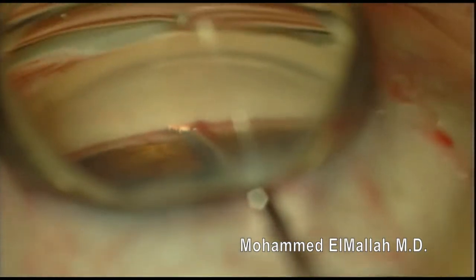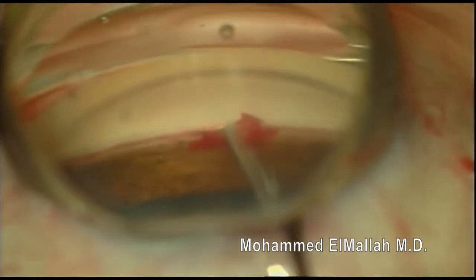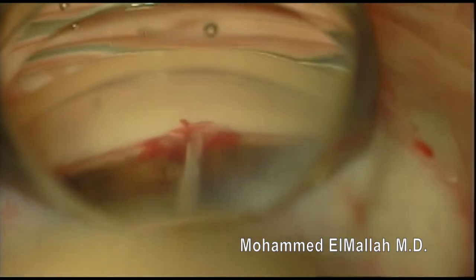And in fact, as I release it, the iStent is not in good position. So I re-grasp before there's too much heme and I attempt to reposition it. However, I'm unsuccessful. I re-grasp the iStent and at this point I attempt to reinsert again from scratch.